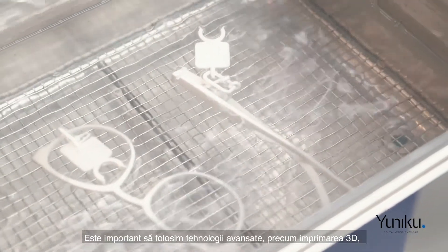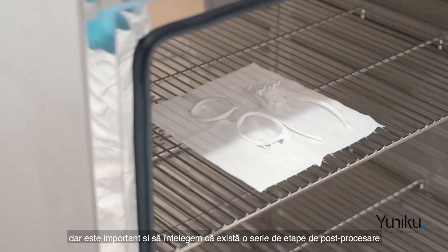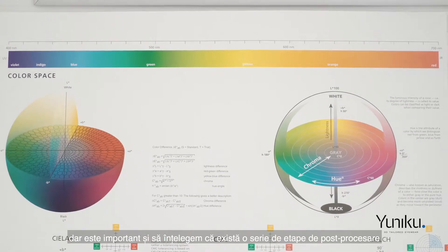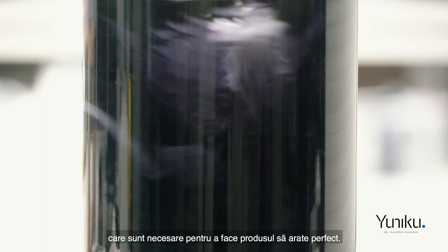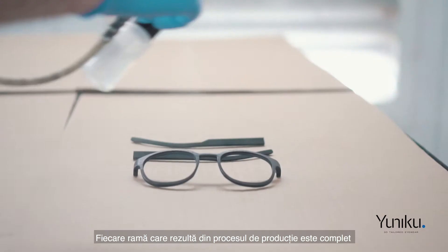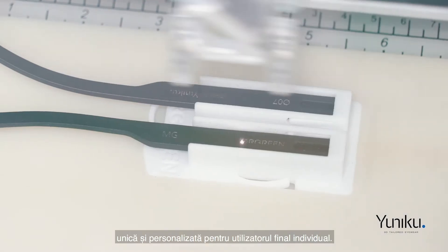It's important to use high-tech like 3D printing, but it's also important to understand that there are a lot of sophisticated post-processing steps required to make the surface look perfect. Every frame that comes out of this manufacturing process is entirely unique and authenticated to an individual end user.